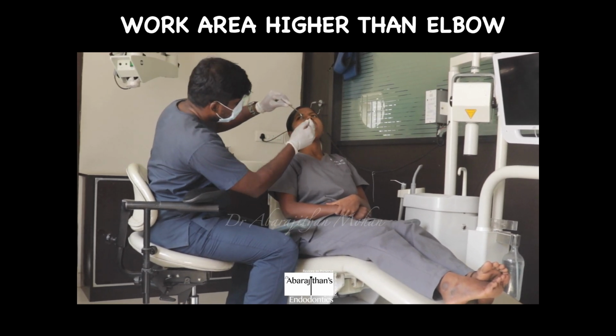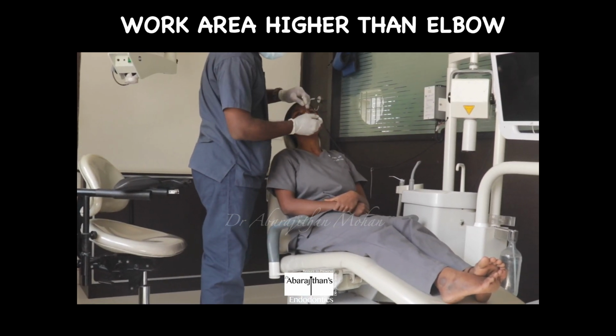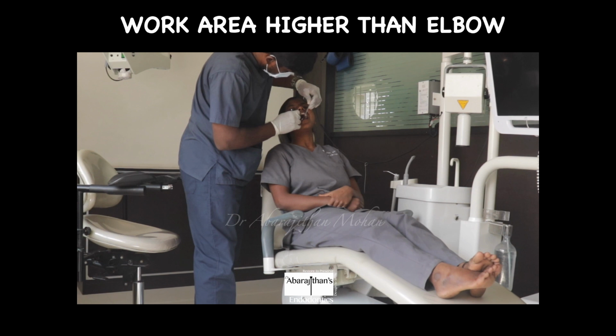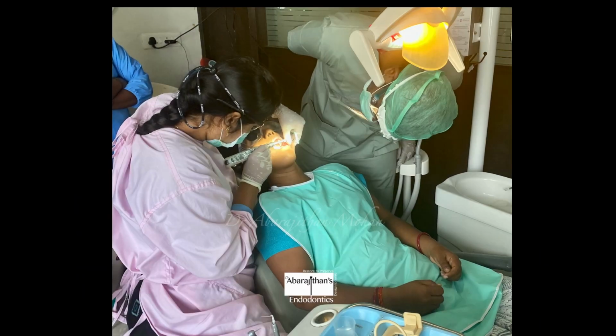So this is a case where you can see how a common mistake most of the time people make. I told you the forearm needs to be parallel to the floor, and this is a common error that we all make when the patient's mouth is higher. Instead of adjusting the chair, people tend to get up from the sitting position and start examining or doing procedures from this posture, which is going to be harmful. So the picture that we saw in the beginning, this is the same error you can see here. The work is at a much higher level than the elbow. So this is not only causing stress to the operator but also to the assistant here.